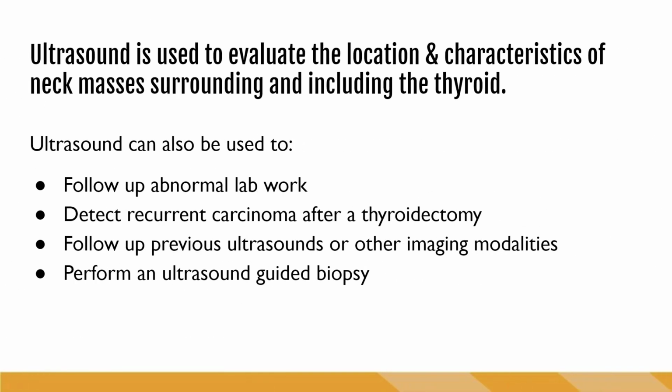The American Institute of Ultrasound in Medicine, or the AIUM, is a fantastic resource for sonographers. And on their website, they list several reasons for why an ultrasound of the thyroid may be ordered by a practitioner. The most common reason that we probably see an ultrasound being ordered is to evaluate the location and characteristics of neck masses in and surrounding the thyroid. Other reasons that we see ultrasounds of the thyroid being ordered is to follow up abnormal lab work, or we can detect recurrent carcinoma after a patient's had thyroidectomy. We can also use ultrasounds to follow up previous ultrasounds or other imaging modalities. And then lastly, oftentimes we use ultrasound to perform an ultrasound-guided biopsy.